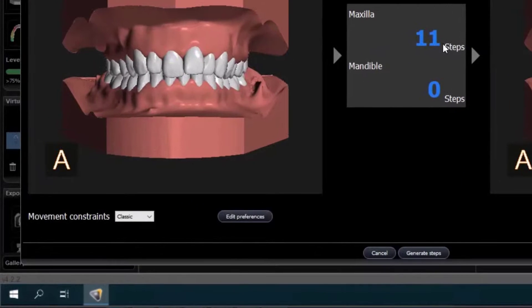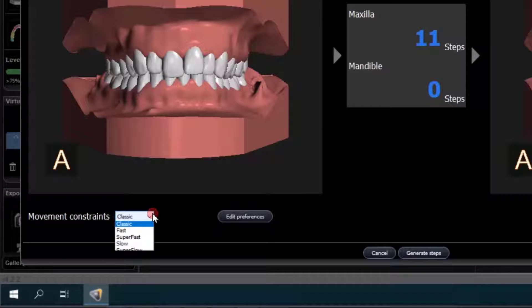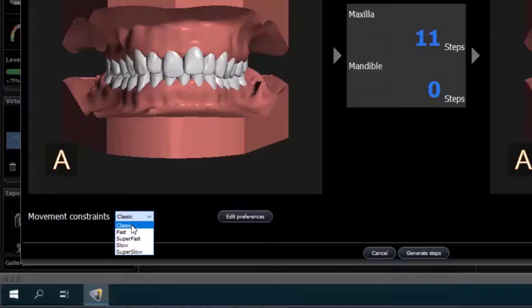In the lower left corner of the screen, you will notice that I have set the Movement Constraint to Classic. These are customizable fields, and you can define your own name for each constraint. Since the Movement Constraint determines the speed at which the case will be completed, I can switch between Classic, Fast, Super Fast, Slow, and Super Slow, and the number of steps will adjust accordingly.